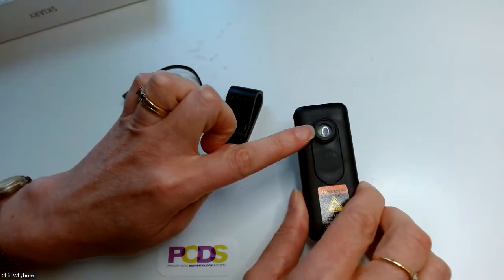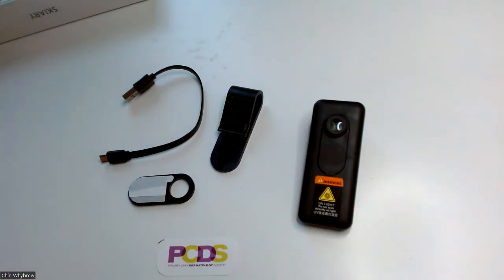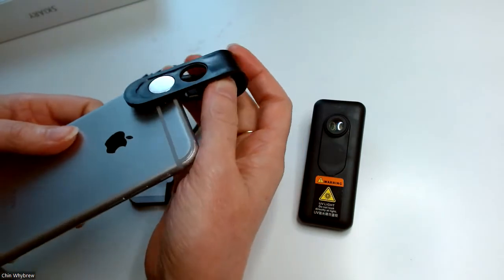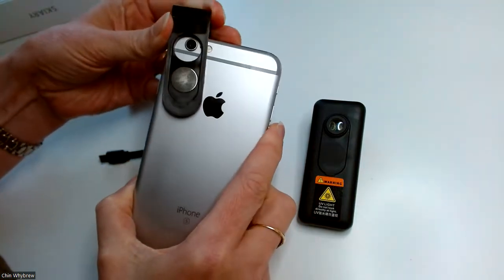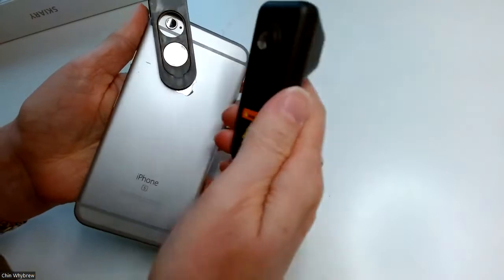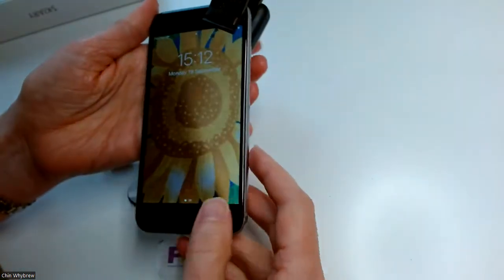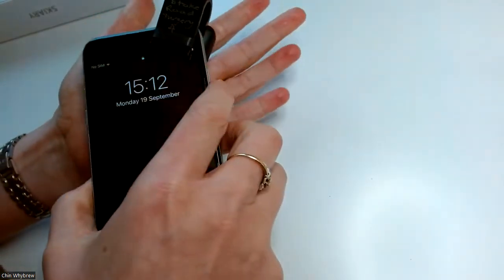As you can see, there is a very small magnifier there. So this is one, again, that you can't look at with the naked eye. You do need to have it attached to a phone to be able to use it. So here's a phone, and the easiest way to use it is with this clip. You just push the clip on like this so that it is holding it roughly over where the camera is on the phone, and this will then magnetically attach onto it so that you can use it through the camera on the phone. So when you turn it on like that, you can then start using it.